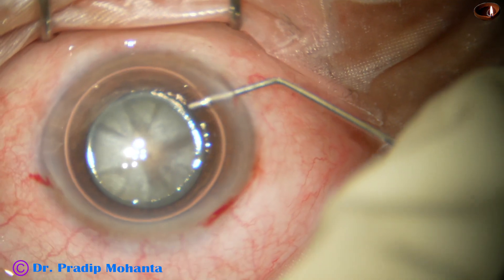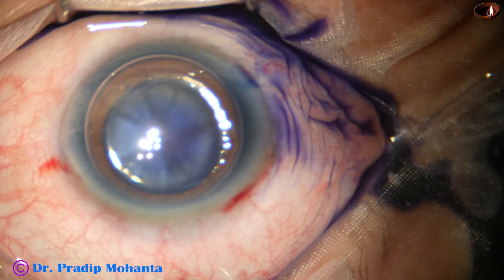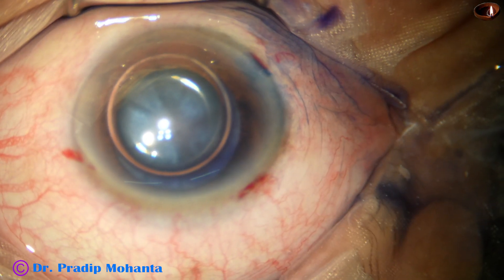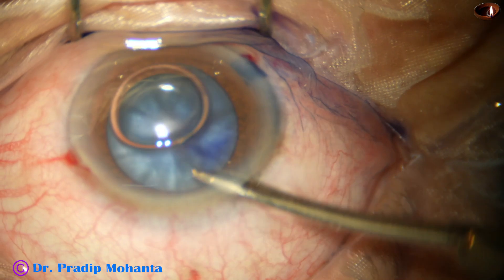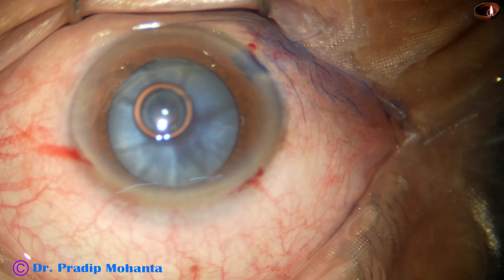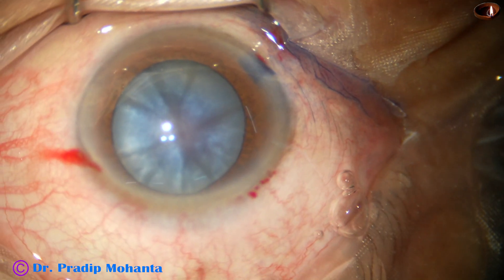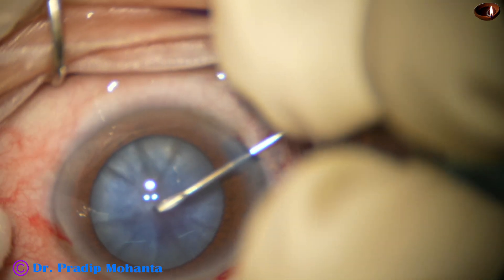The incisions are made and now the anterior capsule is stained with trypan blue dye. This is a bit of adrenalin. The dye is washed out, and then the anterior chamber is filled up with 2% hydroxypropylmethylcellulose.